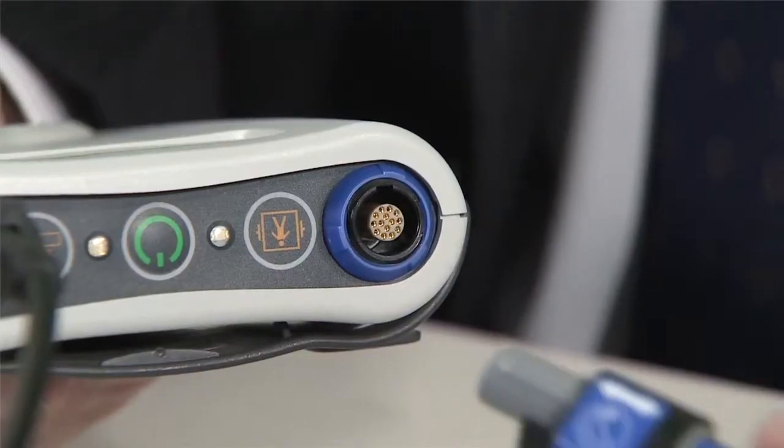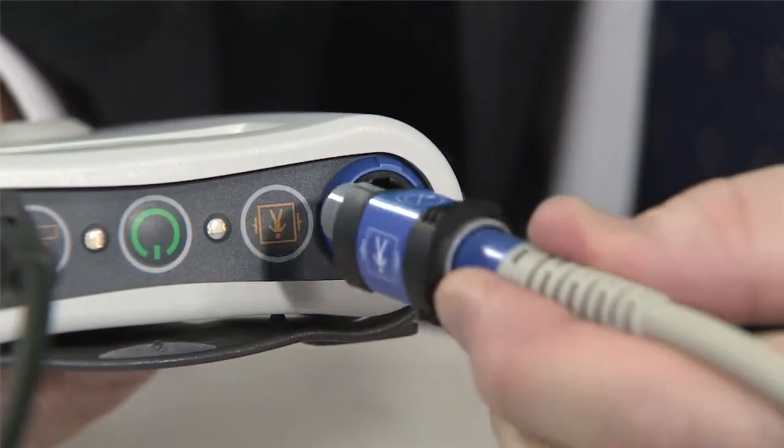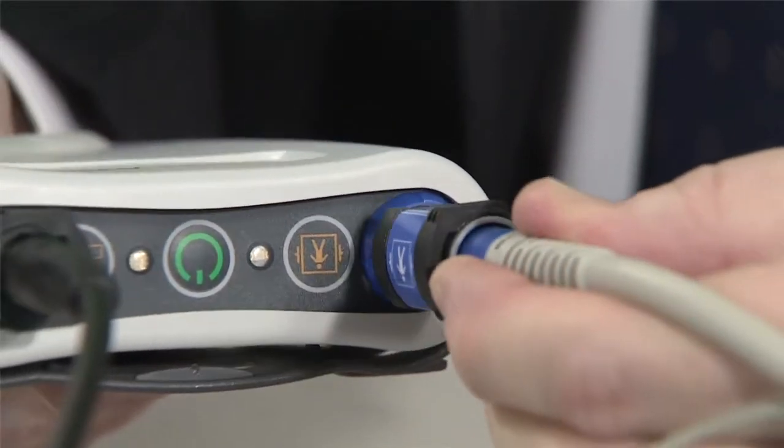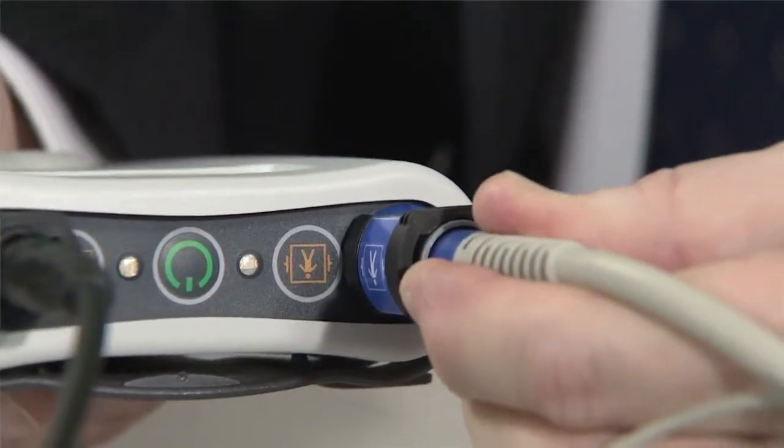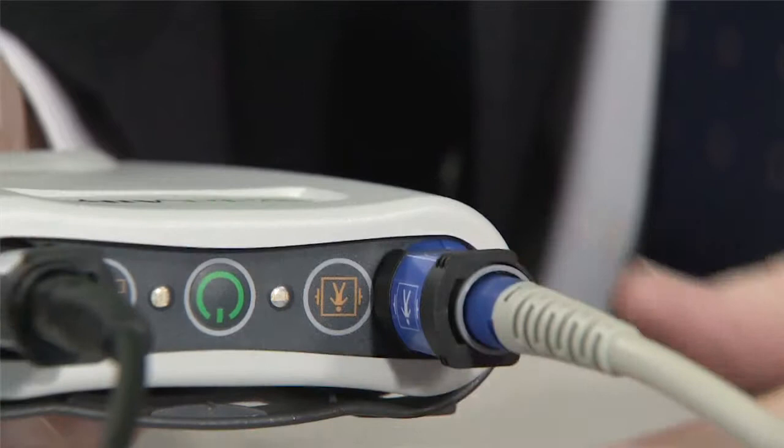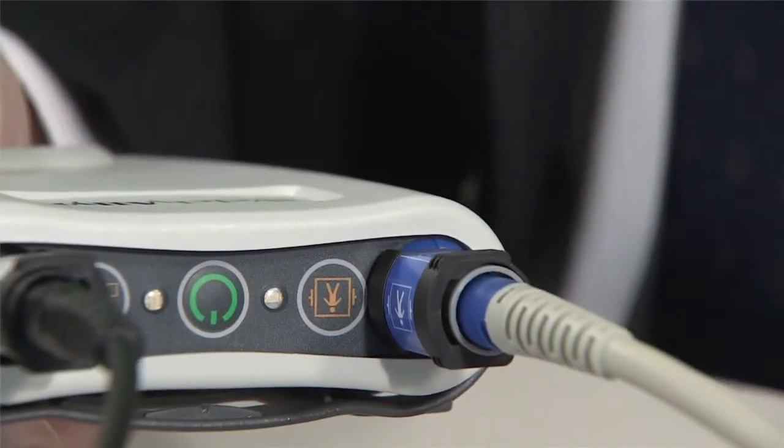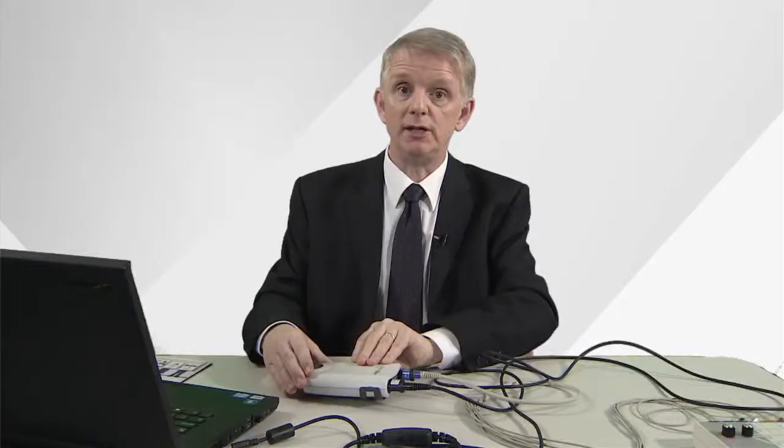The same is true of the patient cable. This time there's a white arrow on top of the cable and again the collar on the inside of the cable points inwards. Those cables won't fit to the ECG any other way.